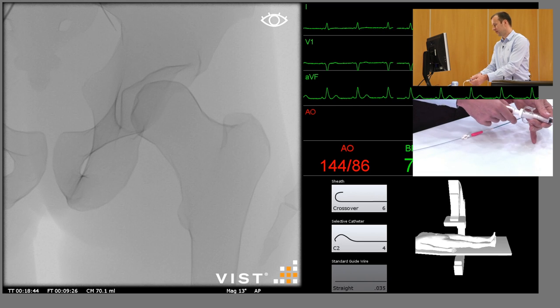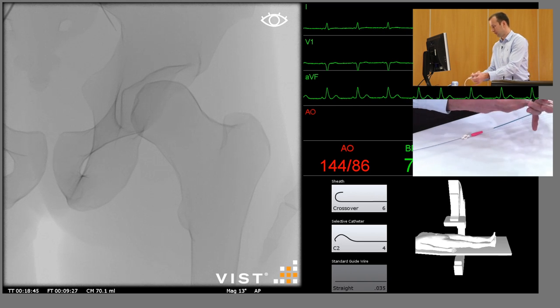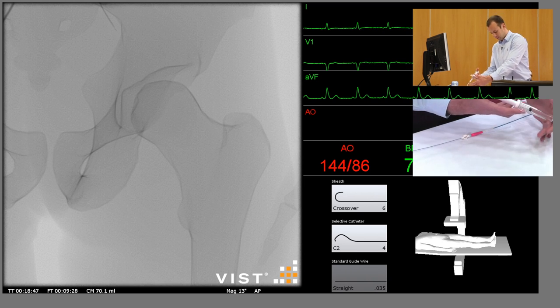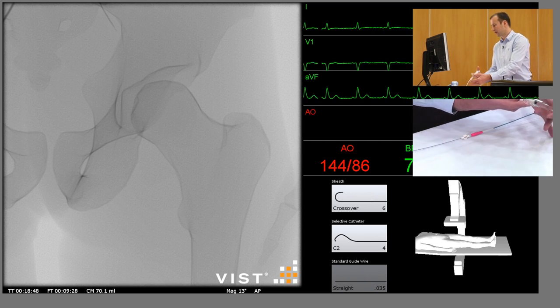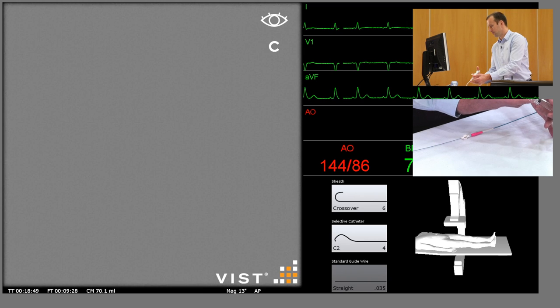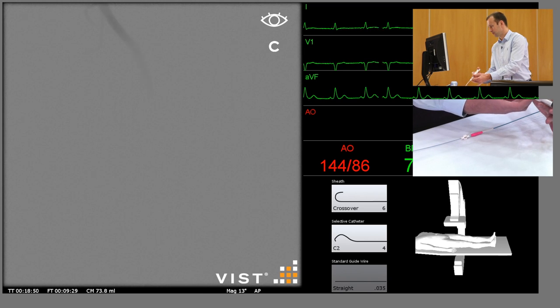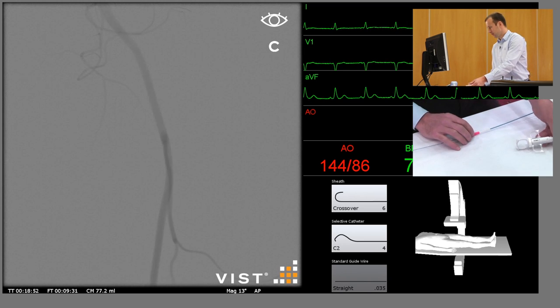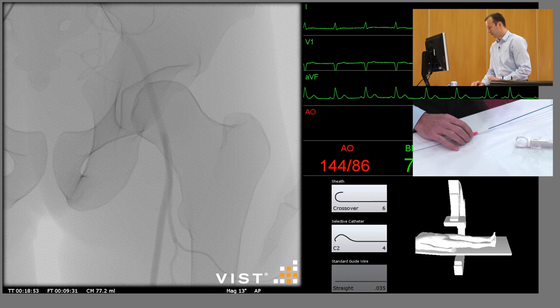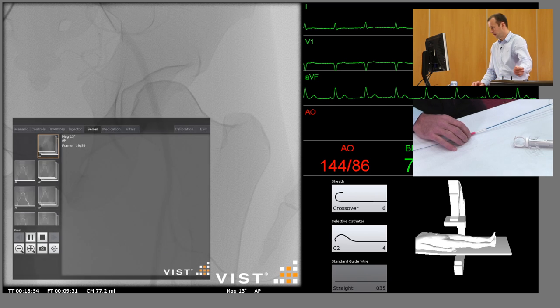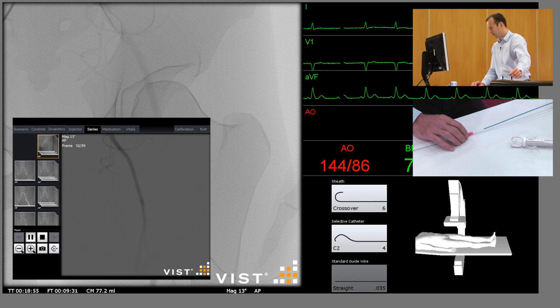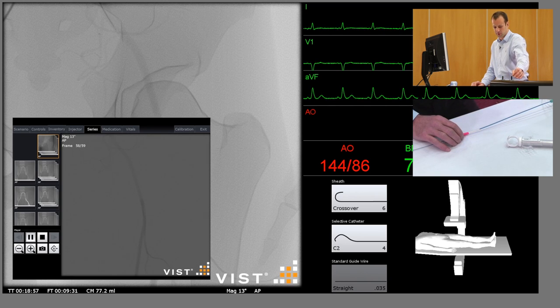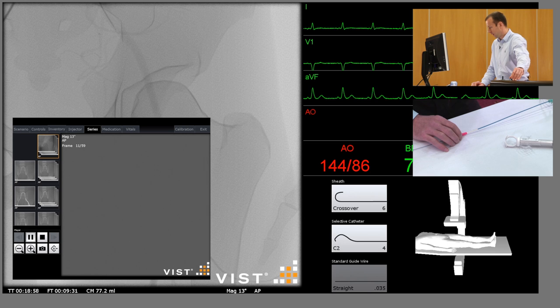And we can take some angiograms from the external iliac artery downwards. So on that run, we can see the bifurcation of the common femoral artery into superficial and profunda femoris.